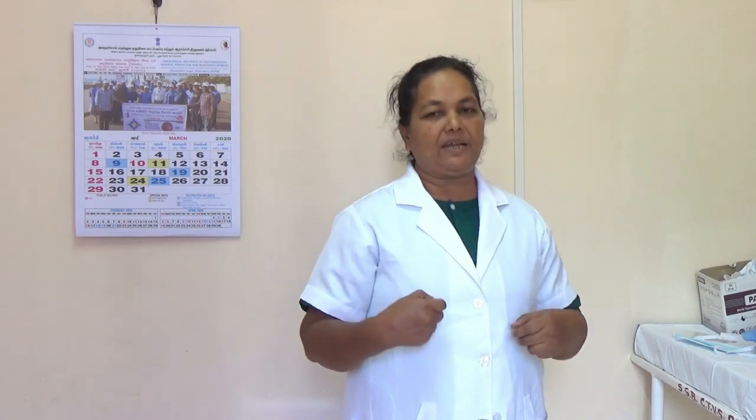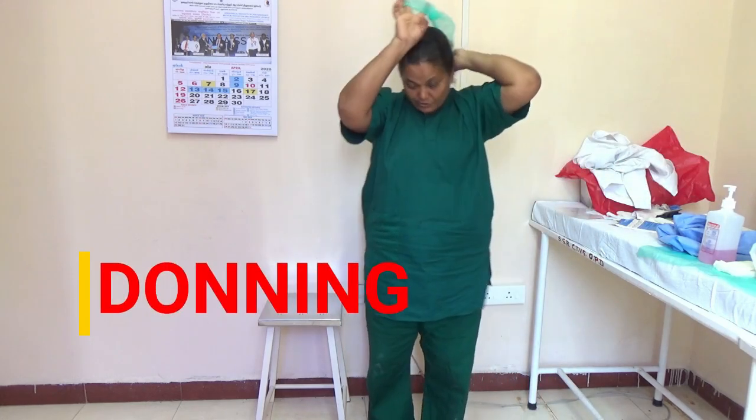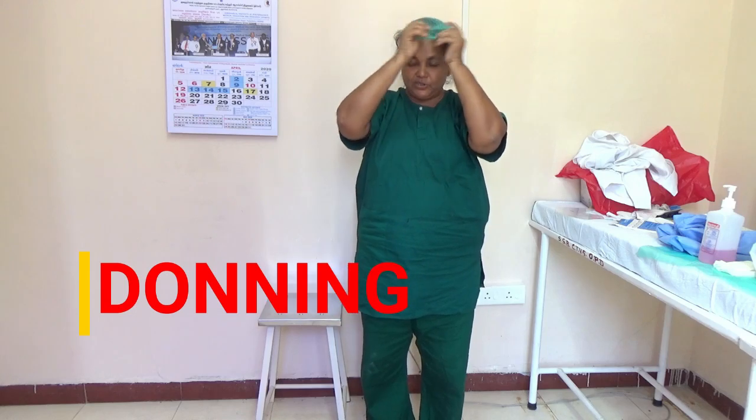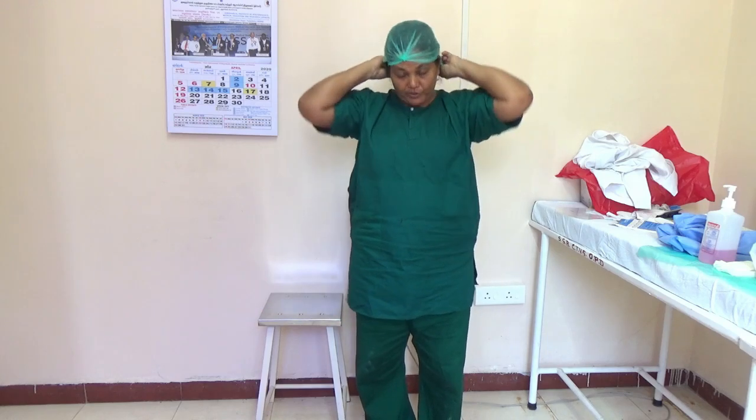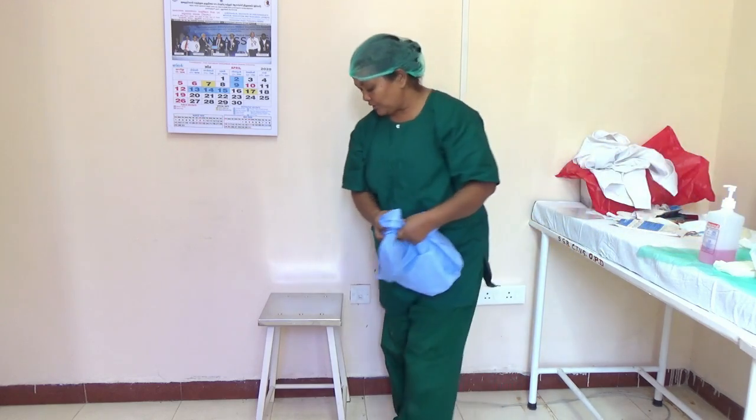Then we have to remove our personal belongings and our own dress, and put on the pyjama in the COVID area. After washing our hands, we have to put the surgical cap first. When you put the surgical cap, it has to completely cover your forehead. Then you have to wear the shoe cover.